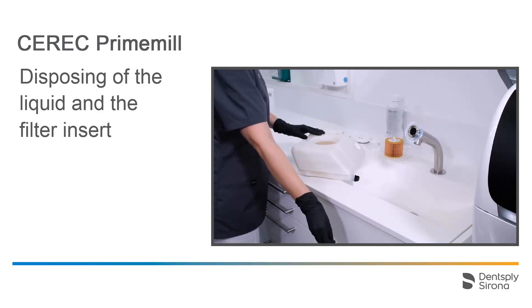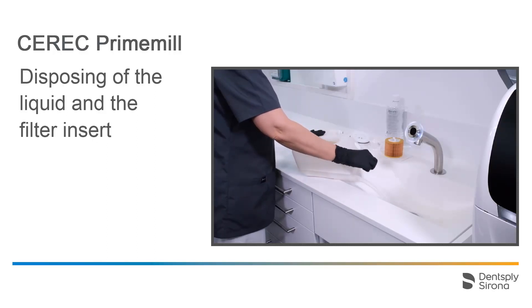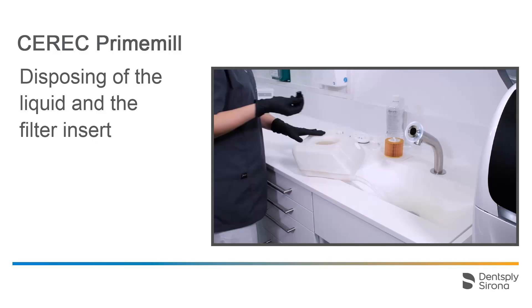Then we open the drain by removing the black cover, allowing the liquid to drain. Rinsing the tank again is recommended.